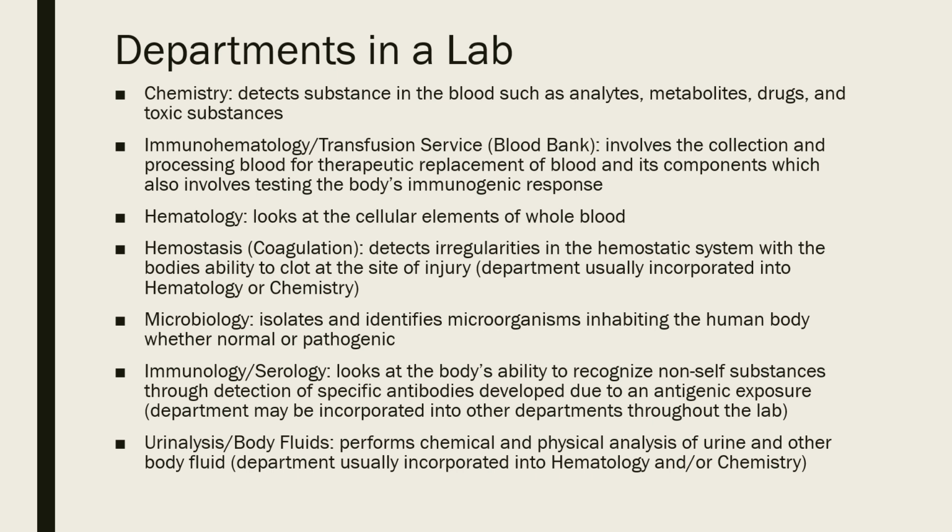It's also important to know where your specimens go. So to do that, you've kind of got to understand the different areas of the laboratory. Your chemistry department is basically going to be various analytes, your glucose, your potassium, calcium, all those things like that. Your metabolites, you have different drugs of abuse, different therapeutic drugs. The chemistry department itself has a lot of tests, a lot of your enzymes, checking your kidney functions, your liver functions. So most of the time they're going to take your green and gold tubes, your red tubes.